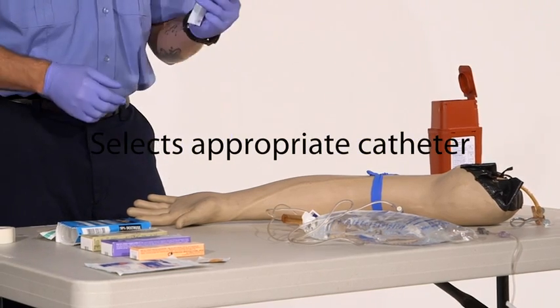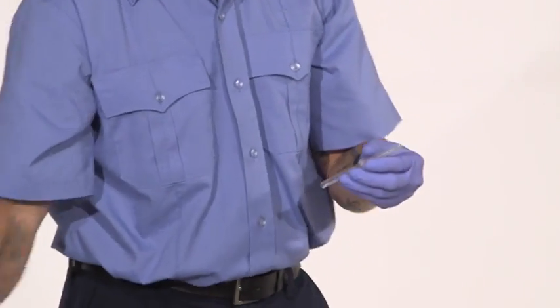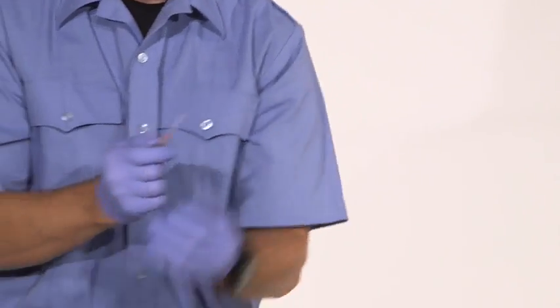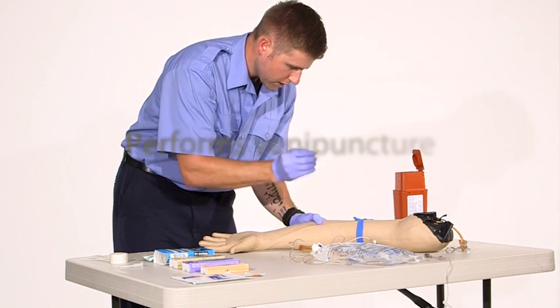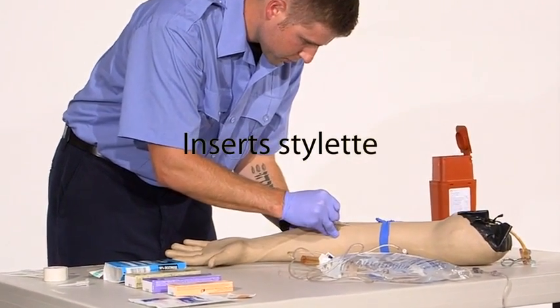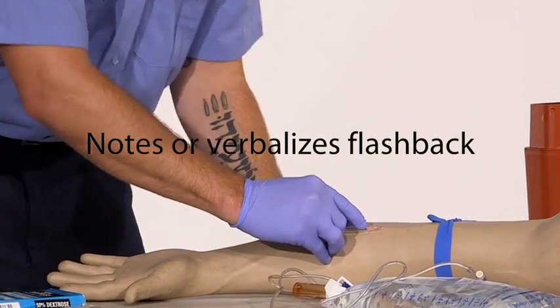I'm going to pick the correct size catheter I have here. Take the cap off. Make sure it's loose. Double check. Traction on my vein. One time. In, level, down, and place the catheter.